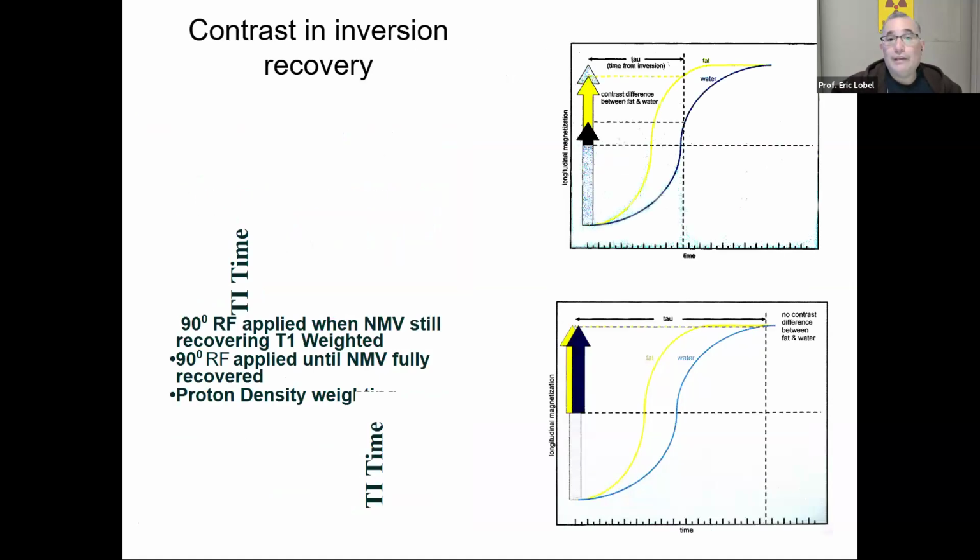So that's what this is saying, being able to essentially turn off the bright signal so that you can see less bright signals that would have gotten swallowed up or would have been easy to miss just increases the overall contrast in your exam. So it's another level that MRI can do, besides weighting in general, that CAT scan can't do, or X-ray. Not even close.